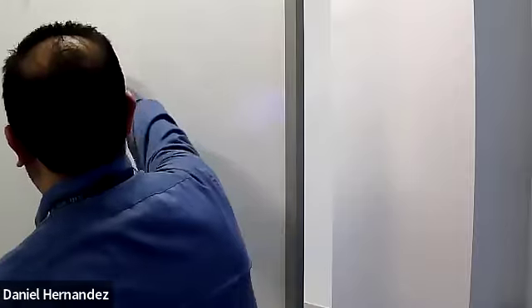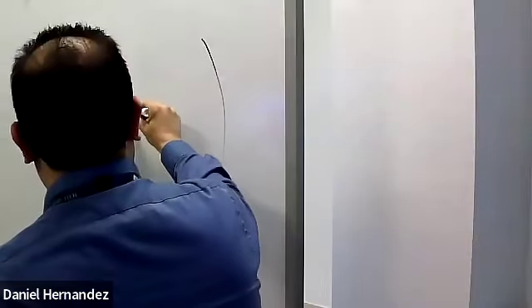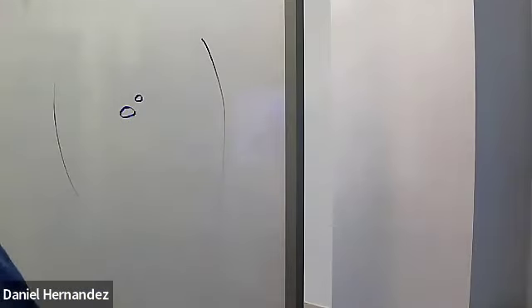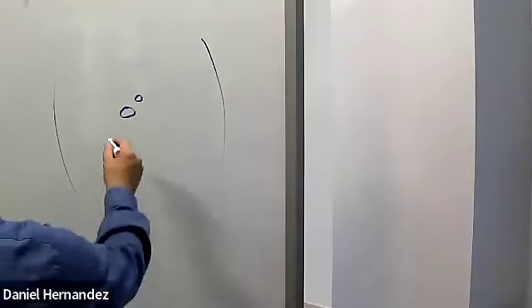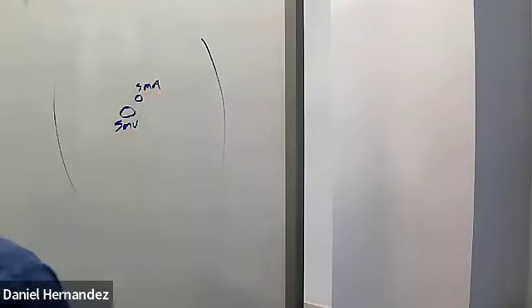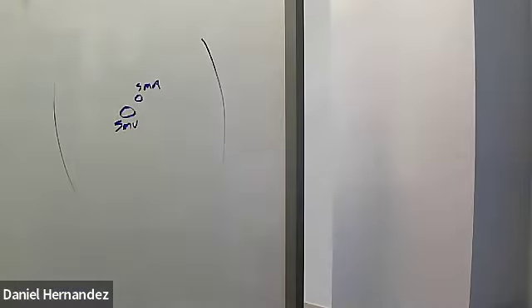So when we're transverse on the abdomen, we look for the SMV and the orientation of the SMA in transverse. Normally, SMA and SMV, if you don't ever remember, SMV should be to the right and SMA to the left. Same as your aorta and IVC: the IVC is on the patient's right, the aorta is on the patient's left. The same holds true for the orientation here. So this is the normal orientation for those vessels.